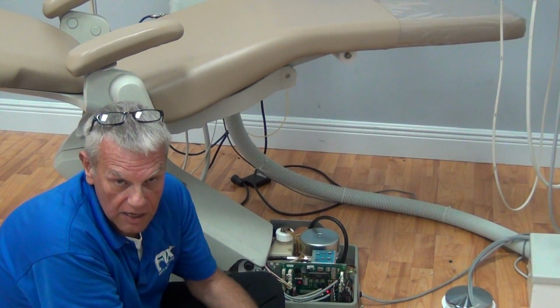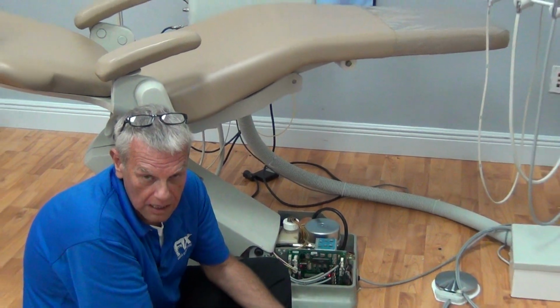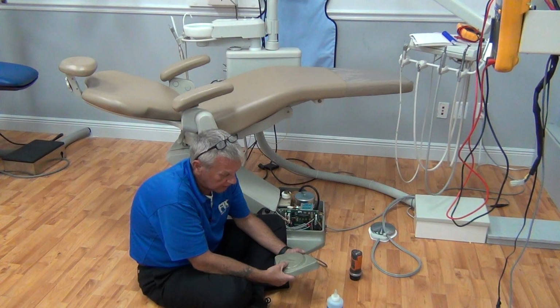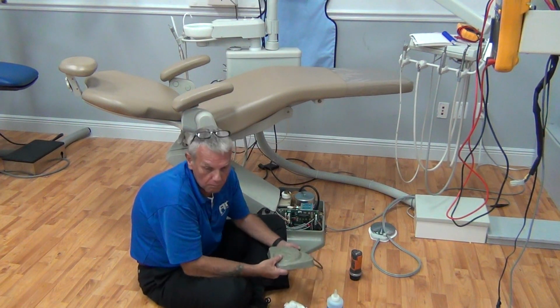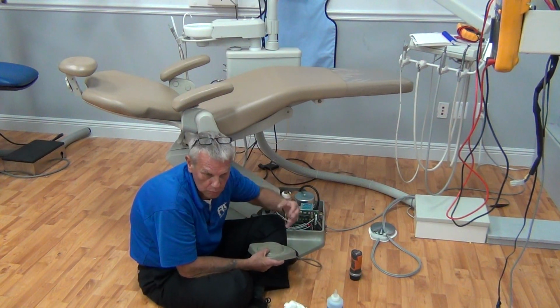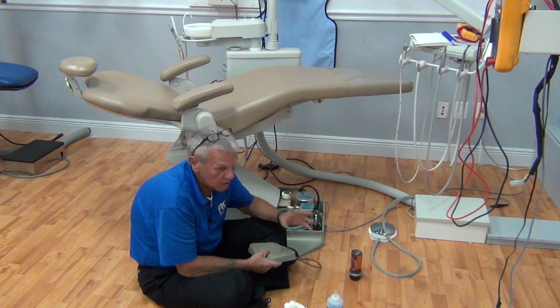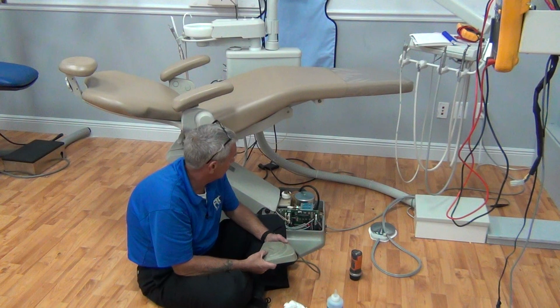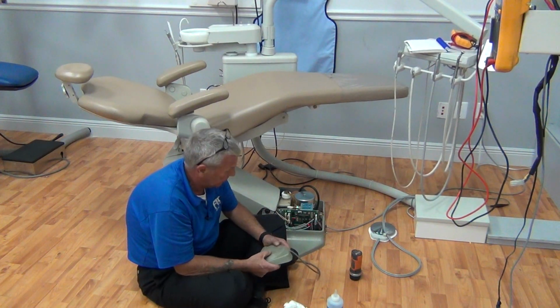Hydraulics must have the air bled out of the fluid to work efficiently and to work correctly. These are designed to self-bleed. You may hear a small belch or a burp from the system where air is blooping back into the oil. That's good. That's what you want to hear. I heard it when we kicked up to go up. Let's see if we hear it when we go down. And this will complete the bleeding procedure.